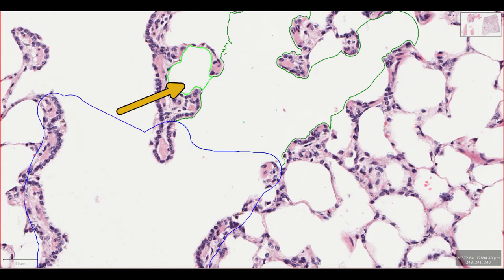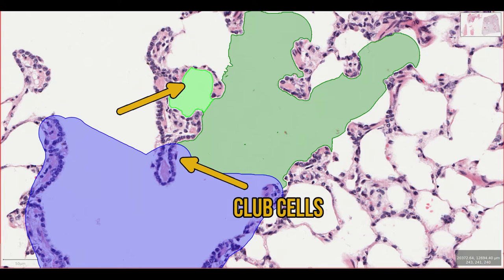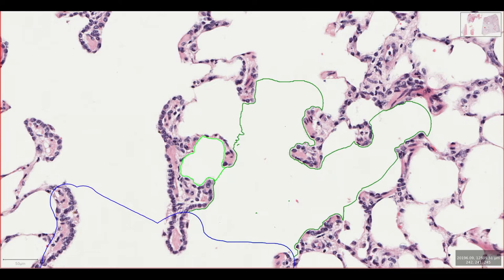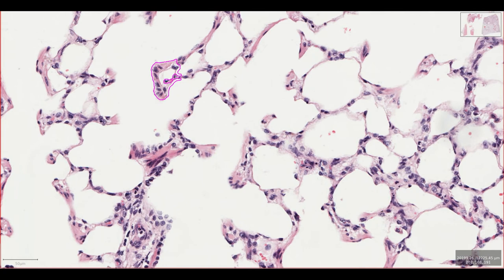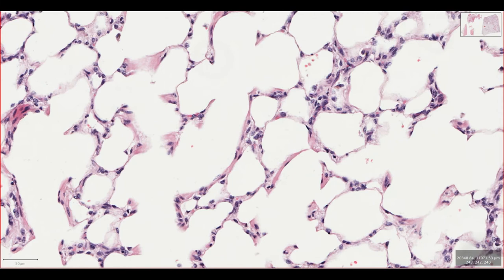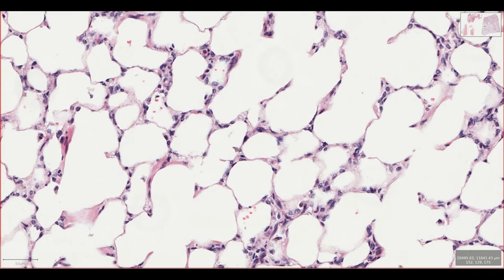The epithelium of the respiratory bronchioles is mainly composed of club cells which secrete surfactant, act as stem cells to replenish the epithelium, and contain enzymes that can detoxify noxious substances. Respiratory bronchioles lead to alveolar ducts which are fiendishly difficult to spot, but we can still make them out as their walls contain small amounts of smooth muscle. These alveolar ducts open out into alveolar sacs which form the bulk of the lung parenchyma and are the main area where gas exchange takes place.